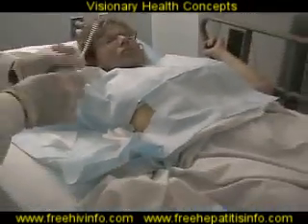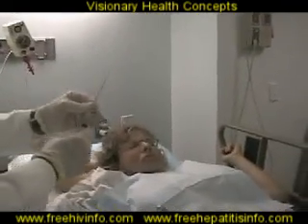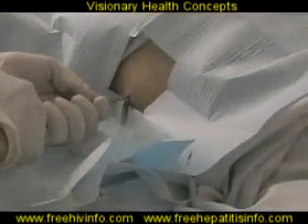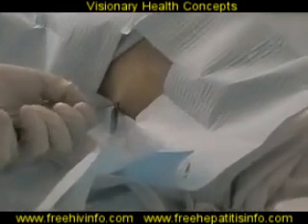It's just a regular hypodermic needle, basically, with a slightly larger barrel. We put a little saline in to cushion the liver biopsy. We put the needle through the skin. We ask the patient to take a small breath in as I put the suction back on the needle. And then we make one little pass into the liver and then let the patient breathe, and the biopsy's over.